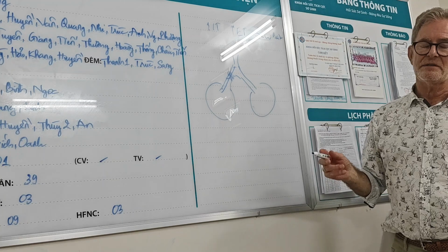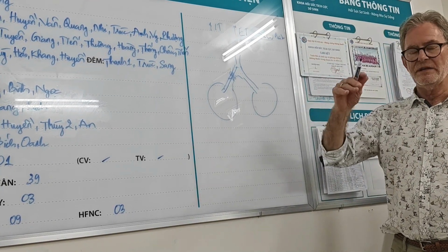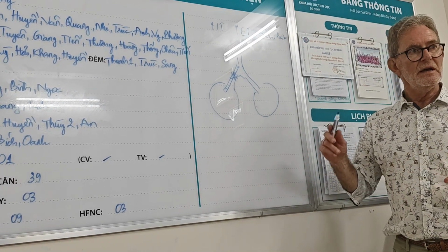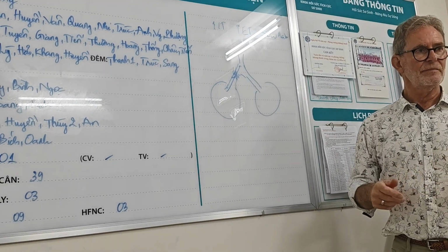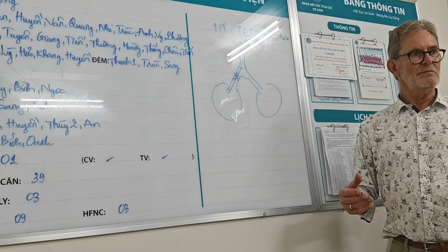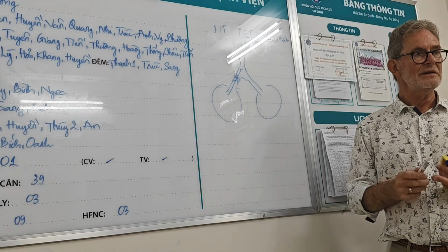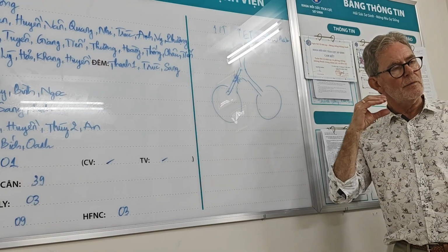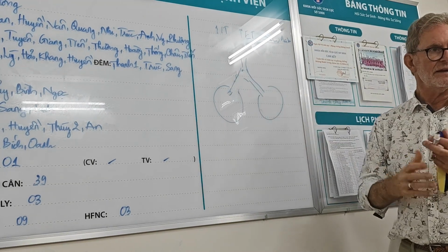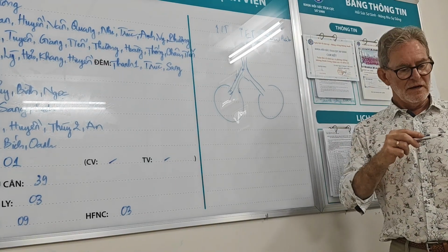Now you'll sometimes see this in a baby, and maybe it will just be on their chest x-ray, one section of their lung is really overinflated and gas trapped. That could be because of bronchomalacia. You've got an overdistended lung, and you think the worst thing you can do is actually put the PEEP up. But in fact, the correct way to manage this is you put the PEEP up, which holds the airway open during exhalation, so that you can now get gas flow out.